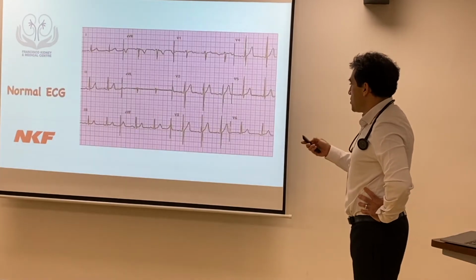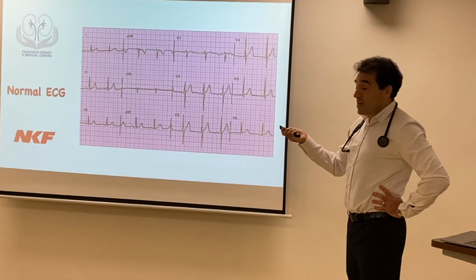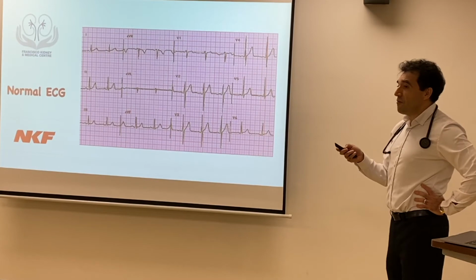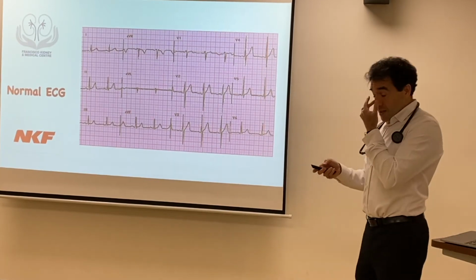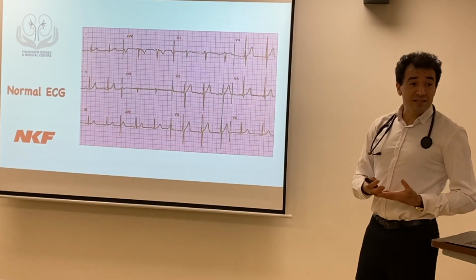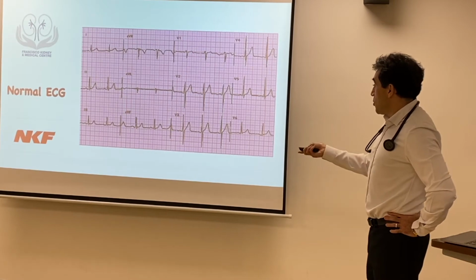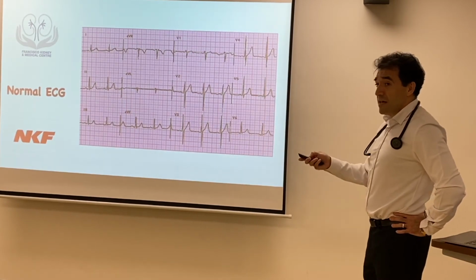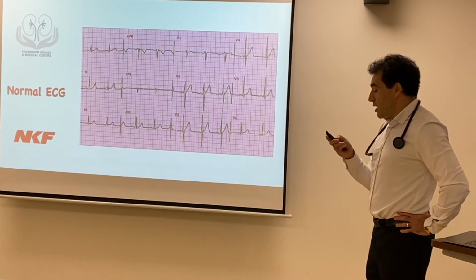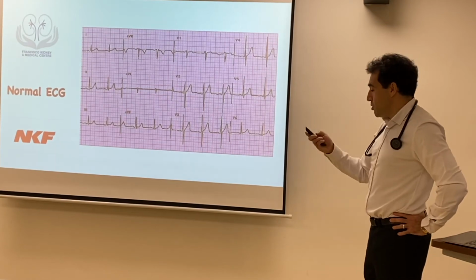But okay, let's just remember ECG normality is very important, especially for myocardial infarction, because you want to identify those ECG changes. If you know what is normal, it doesn't matter that you know what type of myocardial infarction it is. If you know that is not normal, or a normal ECG doesn't look like that, you are already helping everyone. If you are more advanced and you can identify certain types of MI, even much better.